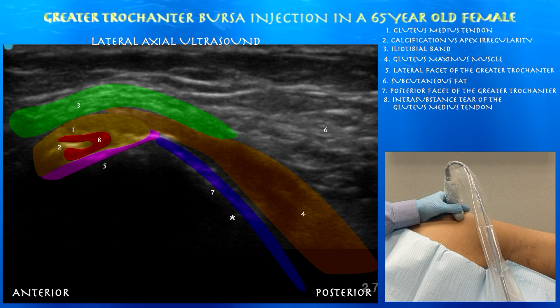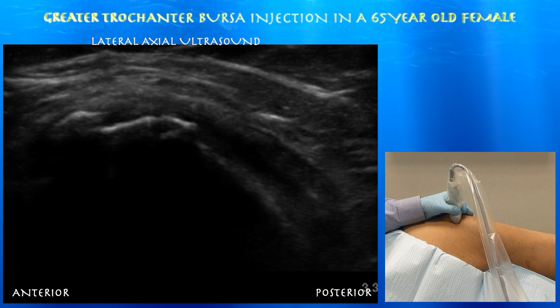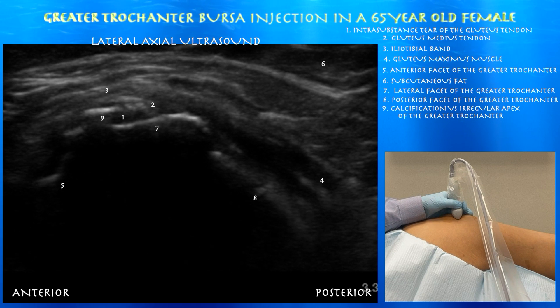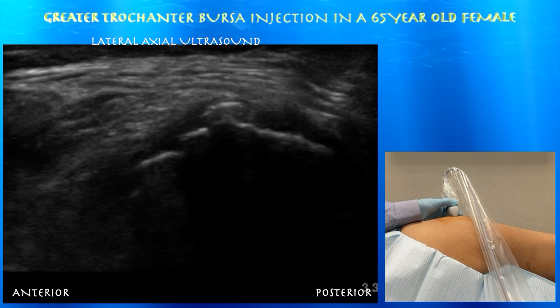Here we can appreciate the posterior facet of the greater trochanter, which is underneath the gluteus maximus muscle. You can appreciate the apex of the greater trochanter — it looks a little bit irregular. This could possibly be some calcification within the gluteus medius tendon, but I'm leaning towards just an irregular apex of the greater trochanter.